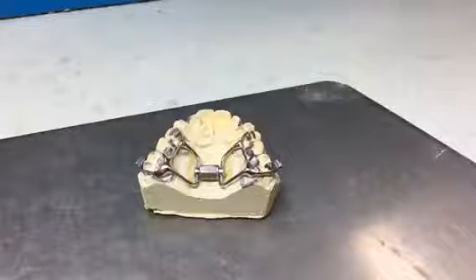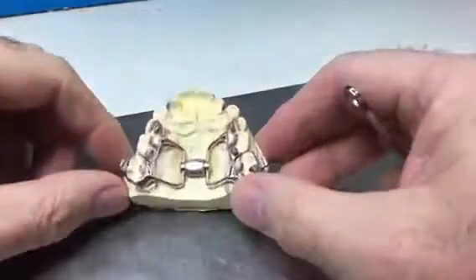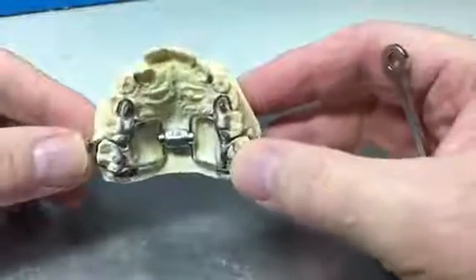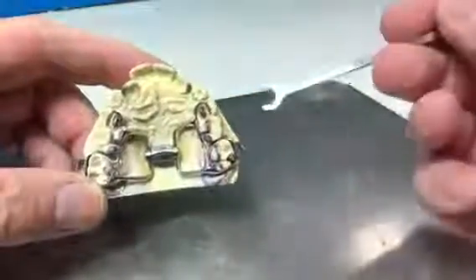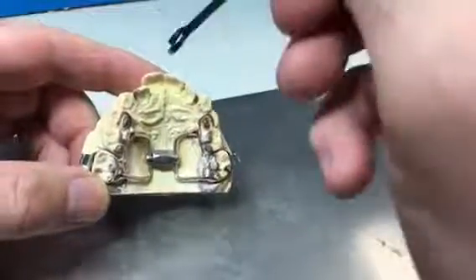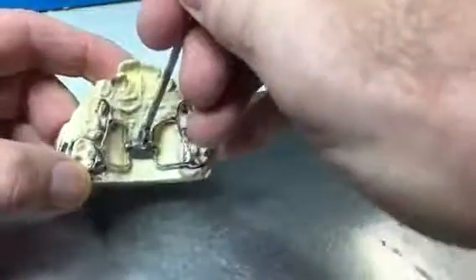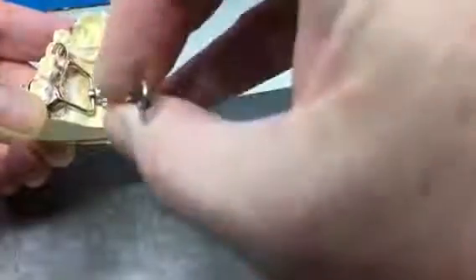Finally, this fixed expander — this screw is known as a power screw. We used to do something called a super screw, but some problems with manufacture have now led us to use this power screw exclusively. It's a fixed expander and the way to activate it is with this special key that comes with it. It's a bit easier than the previous one with the blue swivel key. The key just goes onto the lock nut in the mouth and is just turned as far as you can distally. So it goes on like that, it's locked on the nut and just turned like that.